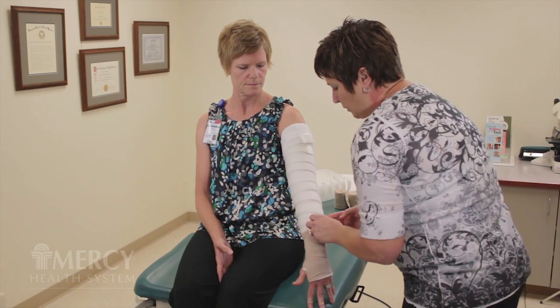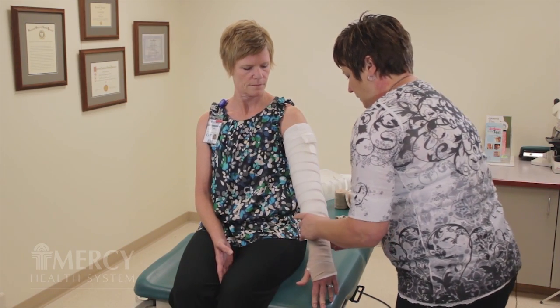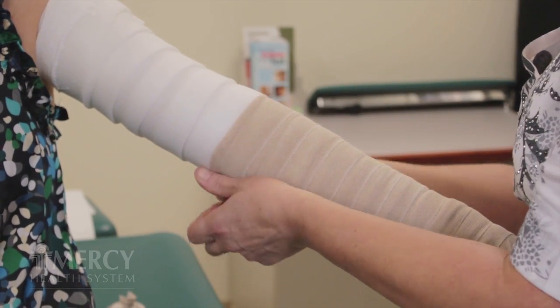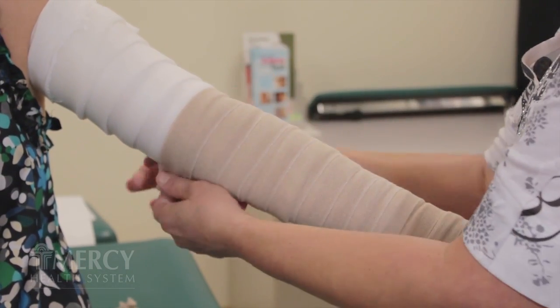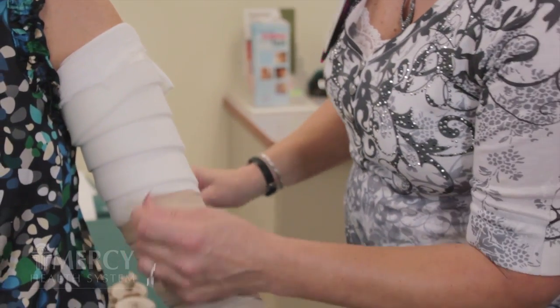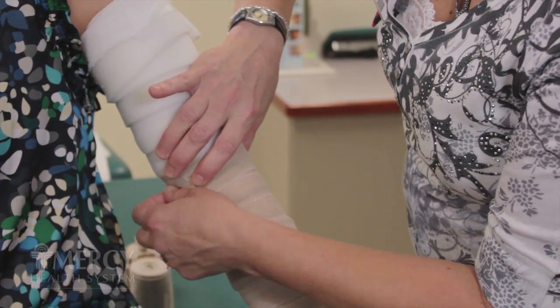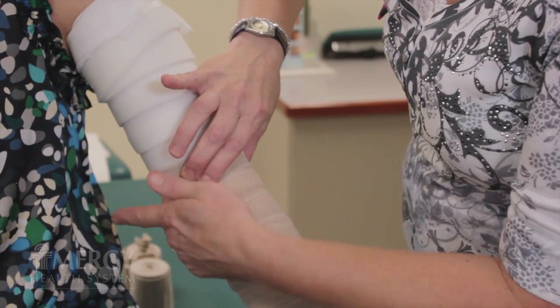If you've got a small arm, the bandage will run out probably mid to upper forearm, and sometimes it runs out right at the elbow joint. It's always good to end either above or below the elbow so that it doesn't get too bulky there. Once I get that layer on, I'm going to take a clip to secure it. The clips are shallow enough so they won't get through the foam and puncture your skin, so they're safe for you. Then I'm going to take a small piece of tape to secure that clip down.